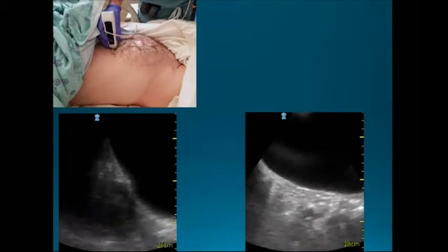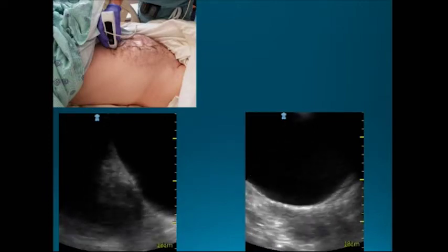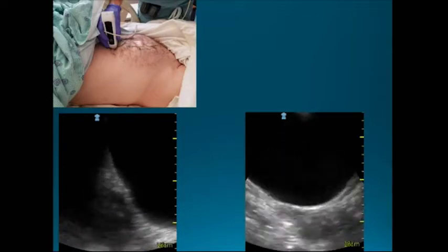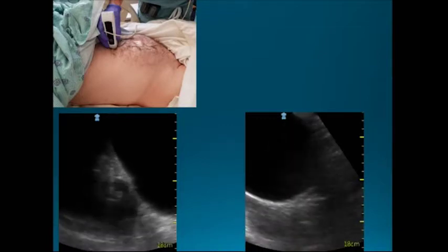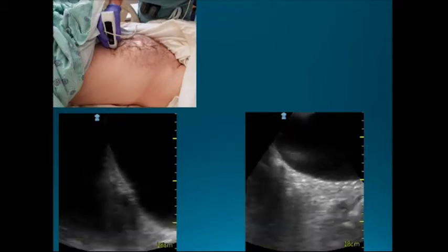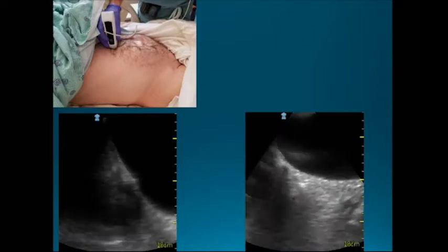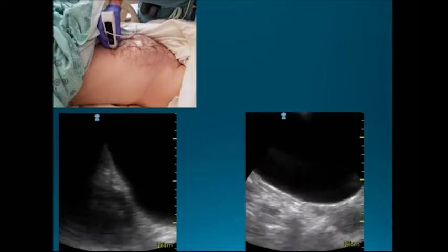So in the clinic, I find that this is very helpful, not only to very quickly assess people's bladder size and rule out overflow incontinence, but also, if they're complaining of incontinence, we'll actually have them void in the clinic. And if we see that they still have a fairly large bladder, we can do quick measurements and a volume assessment of the bladder right there in the clinic and recognize that dysfunction.